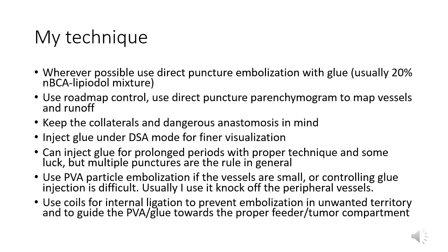With time and repeated procedures, now I have learned how to give prolonged injections of glue and channelize them into different compartments, not the same, but akin to what we do with Onyx. Or in some cases we can achieve extensive embolization with a single puncture, but usually multiple punctures are needed.